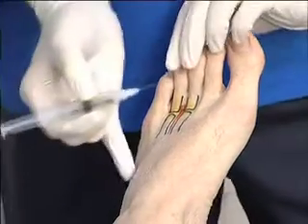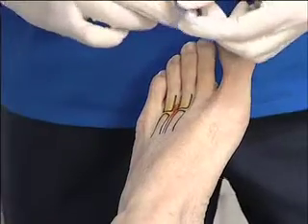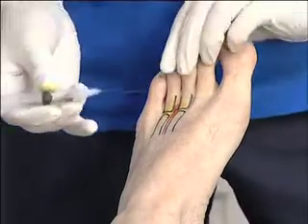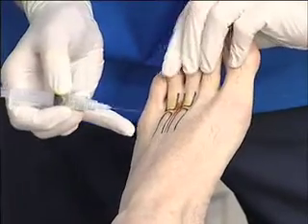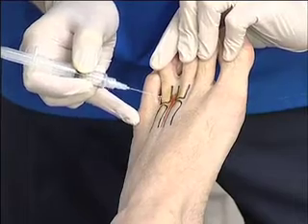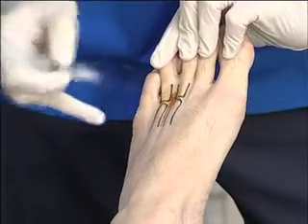I find it very important to hold the syringe very lightly between your fingers, rather than using your thumb. Take the syringe very lightly, stretch the skin, and the point of injection should be just a little bit distal to the metatarsals, because the neuroma will be in about this area here — but deep.